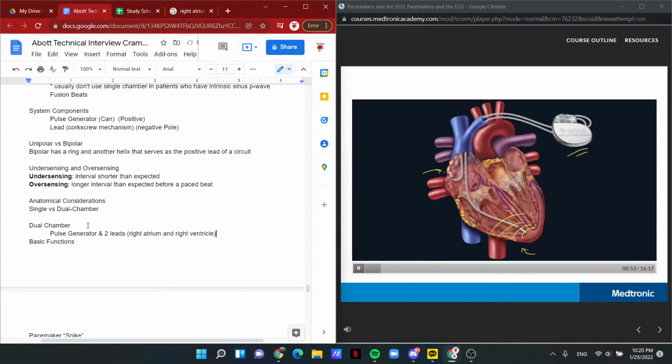The pacemaker system is also capable of detecting the underlying rhythm, and so the pacemaker needs to be able to both sense as well as capture either chamber, with the goal being to maintain the proper timing between the atria and the ventricles, known as AV synchrony. In order to accomplish all this, the pacemaker circuitry has to be very complex, much more than a single-chamber pacemaker.